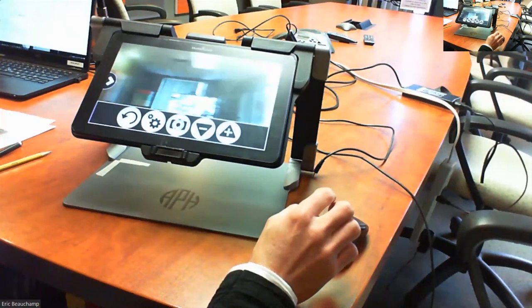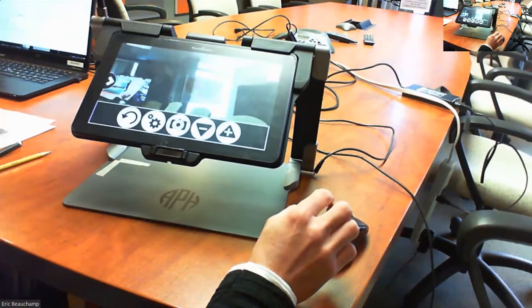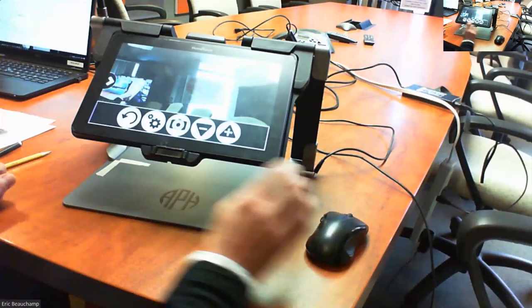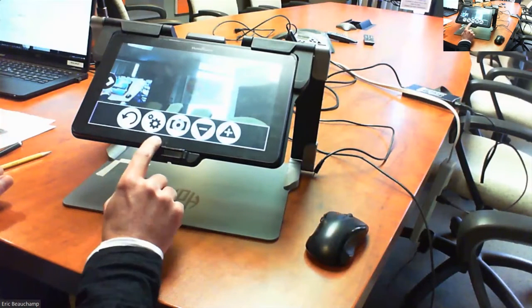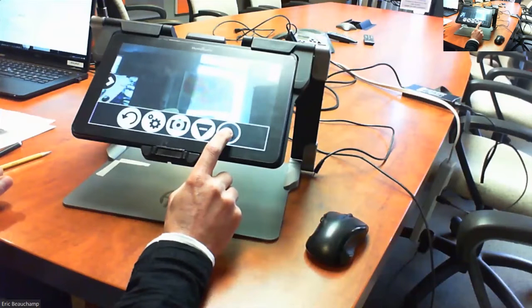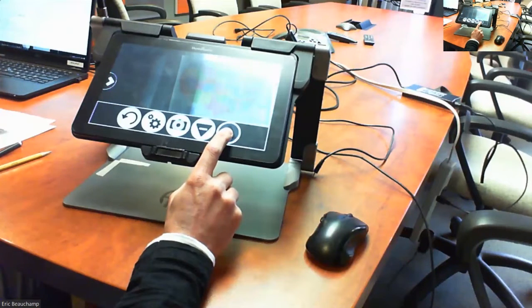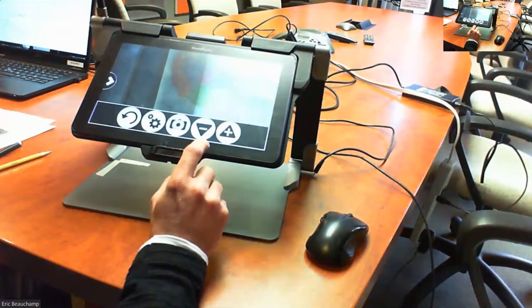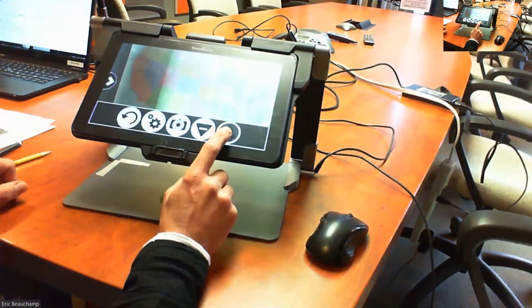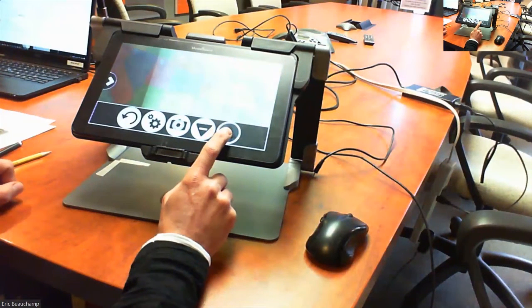So, like I said, the teacher wants me to zoom in to a map here. You can zoom in using the button banner on the screen just by pressing and holding that plus button. It's going to zoom in gradually until you can get that close-up that you want. Right now, I have that map about 20 feet from where I'm sitting. So you can zoom in really nicely.